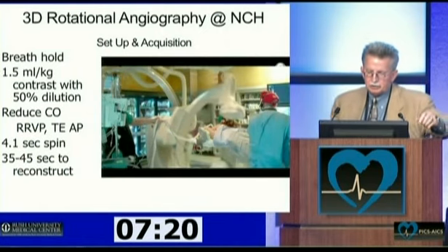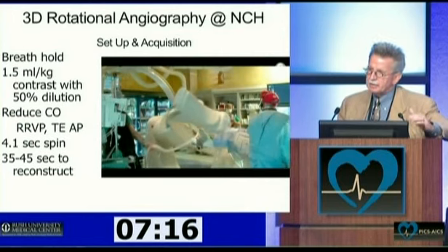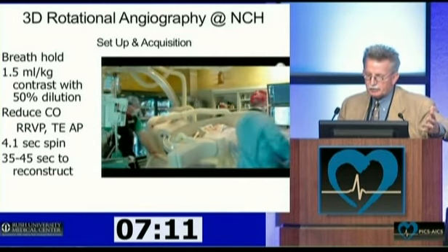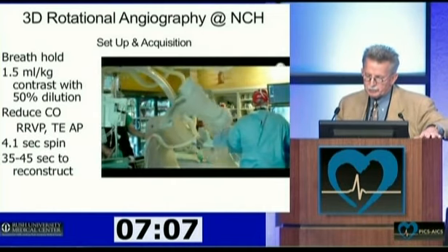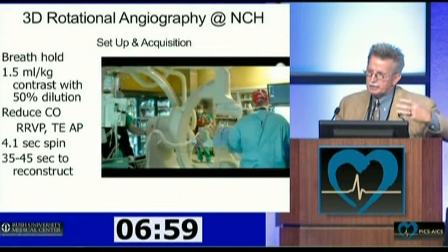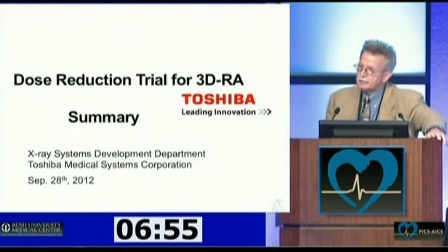Now I'm just going to quickly lead into 3D rotational angiography, going into the OR suite, and Evan's going to talk a lot about 3D rotational angiography, and we'll also talk about some of the things Lee did. This is easy to do, obviously. It's all integrated into the system, because this table and all the cameras are integrated together. But we're also going to have to do this in the OR.